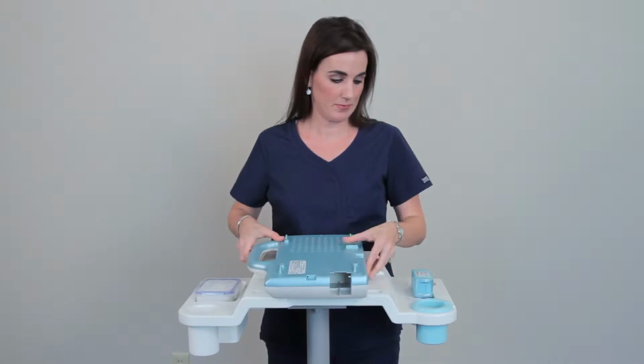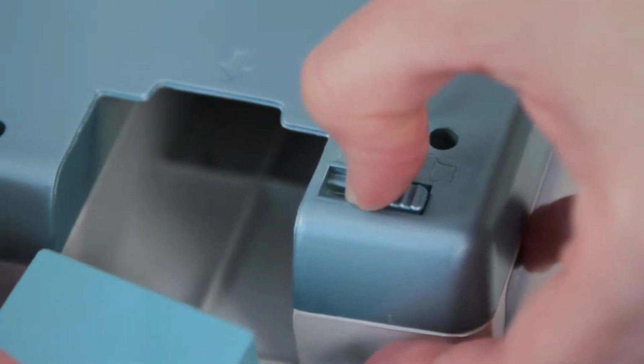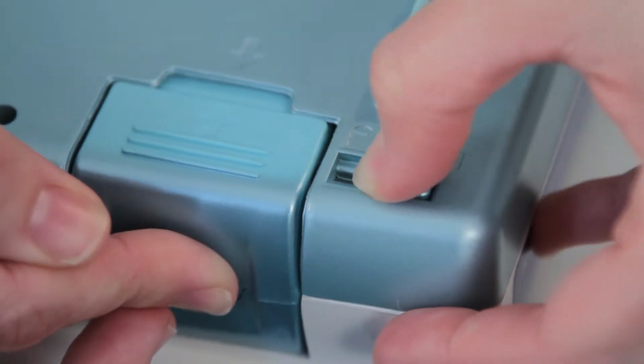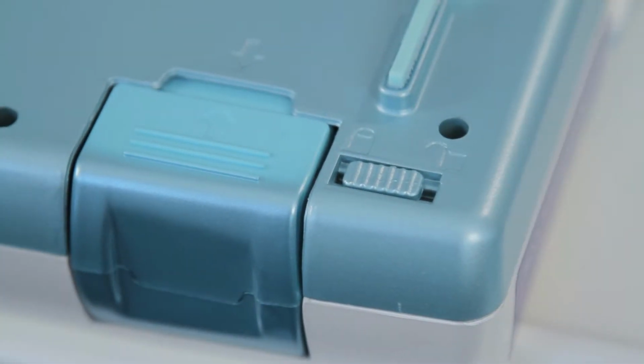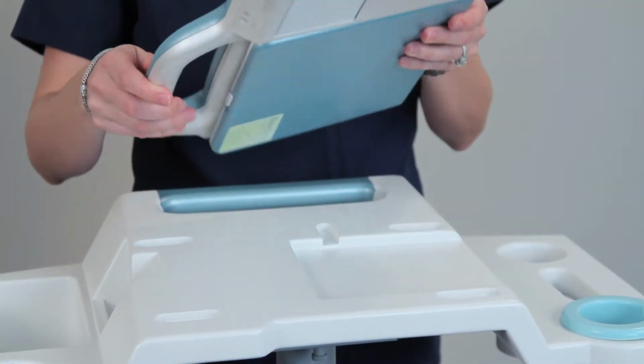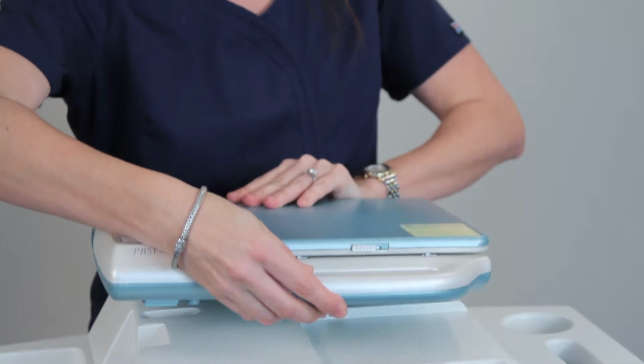First, make sure that you properly inserted the battery. Pull the plastic latch back completely and slowly insert the battery inside the slot. Make sure that you hold the plastic latch while inserting and removing the battery. Once the battery is secure, flip the unit back over to attach the probe.